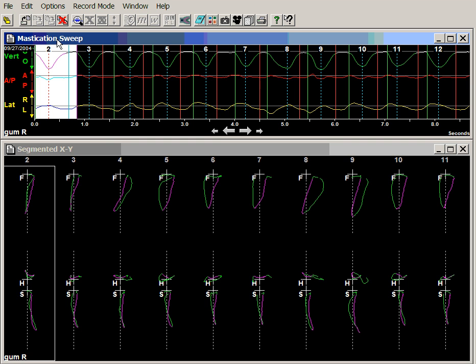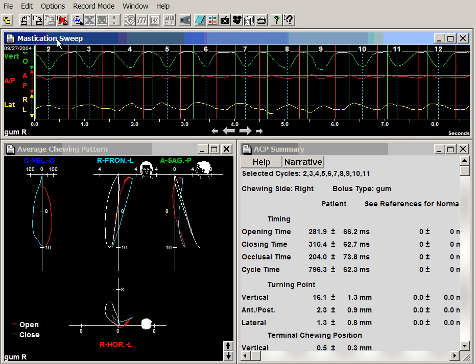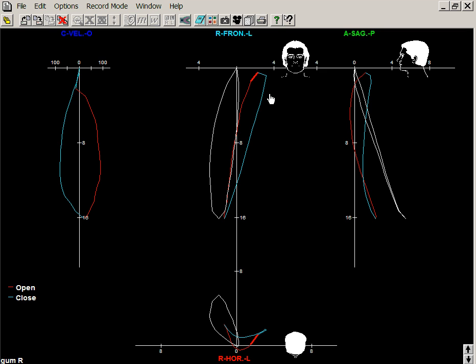If we average these cycles together, we get a somewhat strange-looking average chewing pattern that is very square-looking, particularly in the area of occlusion. To some extent, that is due to the fact that there is so much variability in that area.